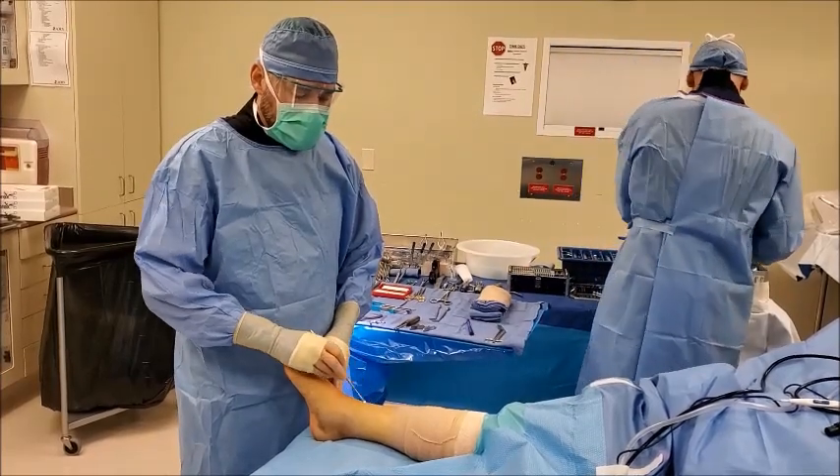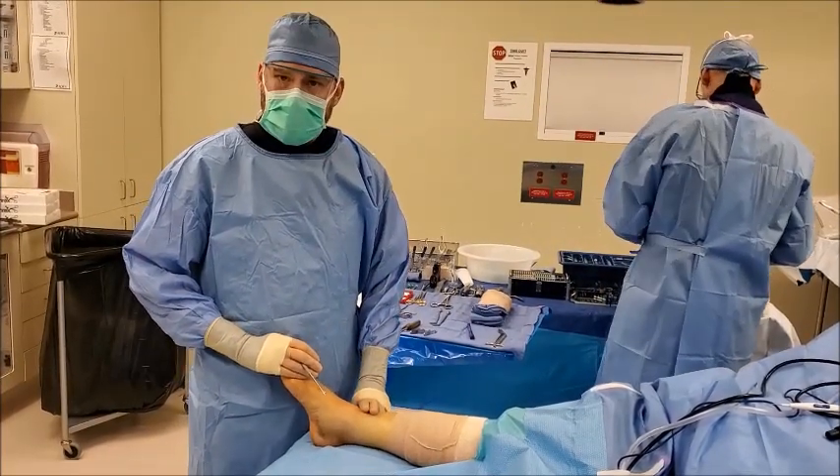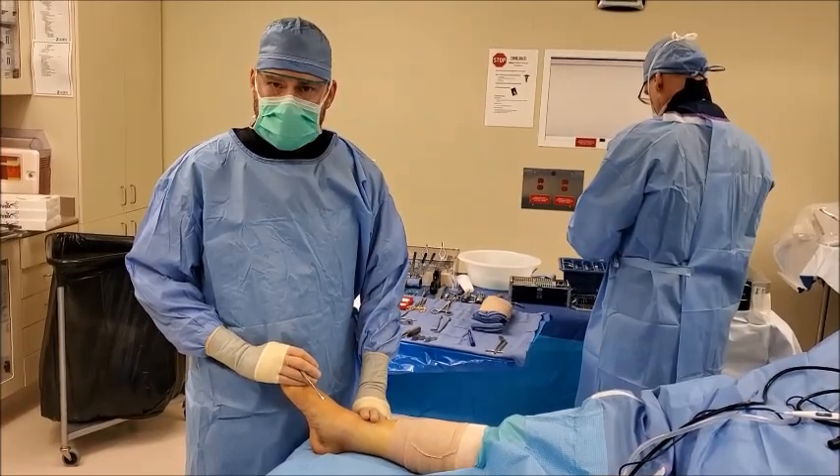At the same time, we'll be repairing the broad ligament that holds the two long bones of the leg together to create stability, called the syndesmosis.